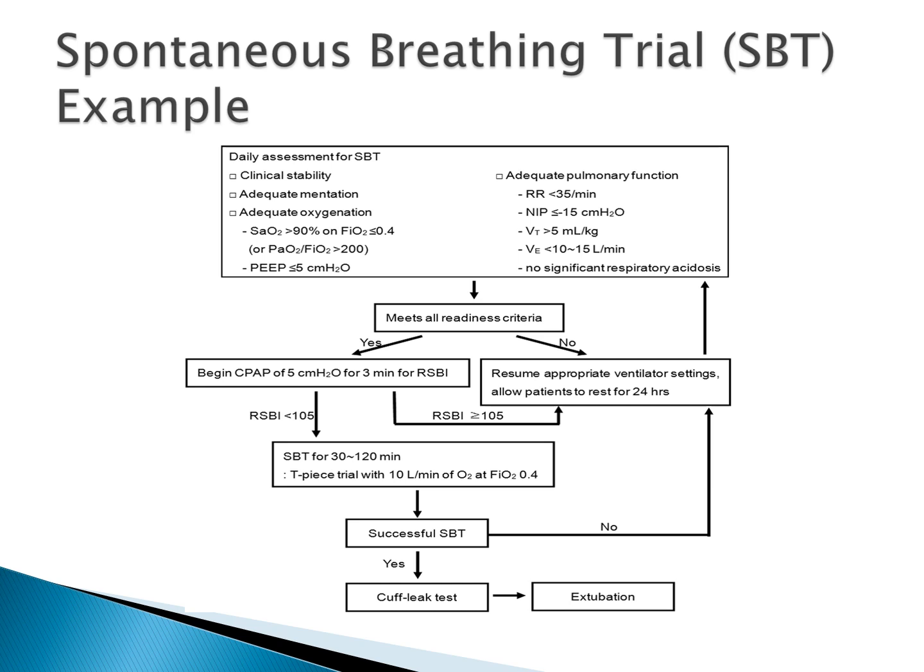If their RSBI is not good, you then actually resume the appropriate full support, the assist control, the VC plus, pressure regulated volume control, etc., and allow them to rest typically for 24 hours. All right. The exception to that would be if the patient is sedated, but they're otherwise stable, and you assess them, let's say, in the morning, you may actually want to lighten their sedation for later on and continue the process and perhaps do a second assessment in the early afternoon.